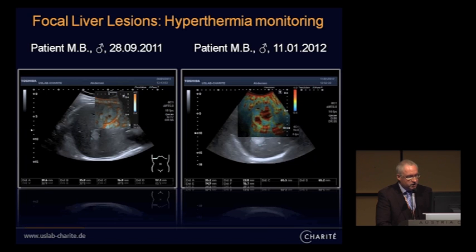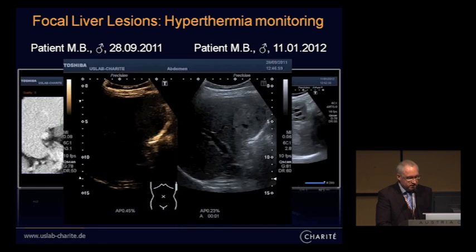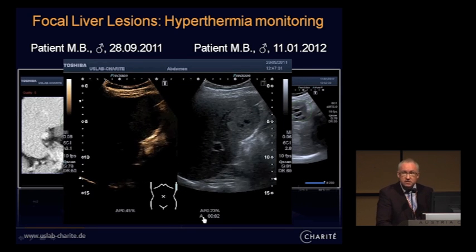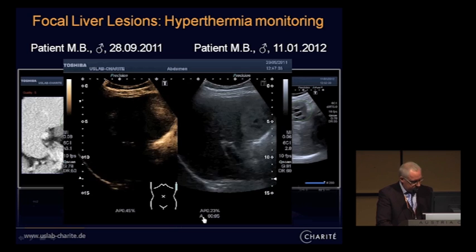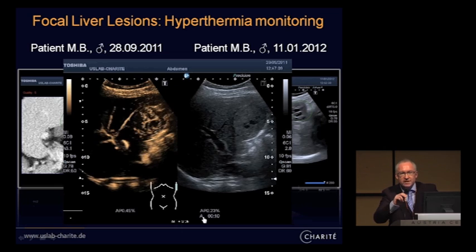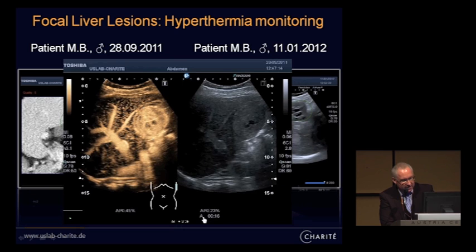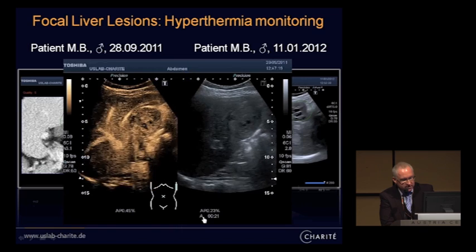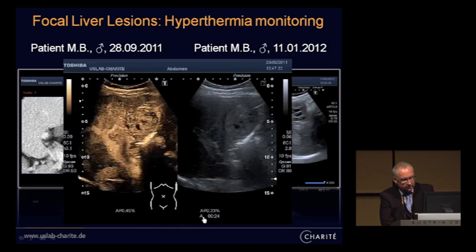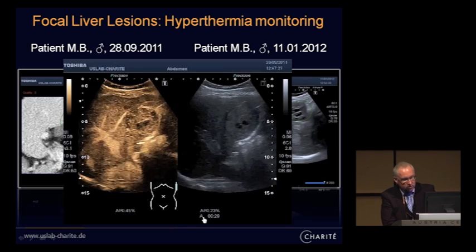This is the CT scan before, direct correlation to the high-resolution ultrasound, and once again, the progressive disease very well visible on this rim, and we see a lot of, oh, what's no? Problem with the technique? Okay, now we start once again with the same slices. No, not. So I will click forward, of course, really fast. Fishing experience, very nice. Not good for the beamer or for the technique here, but good for us in our daily routine.